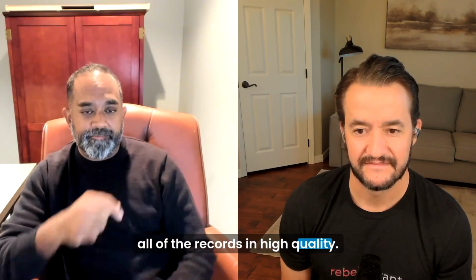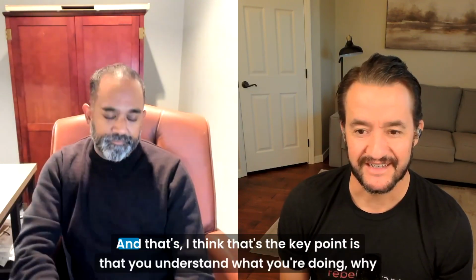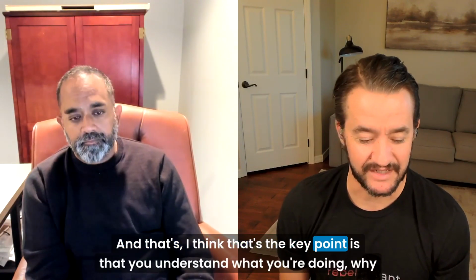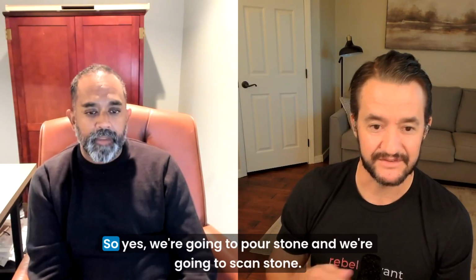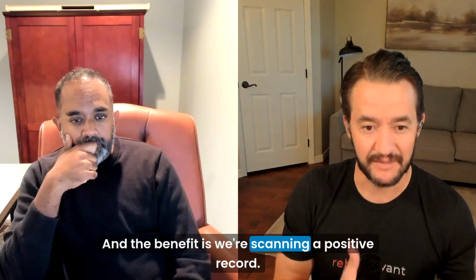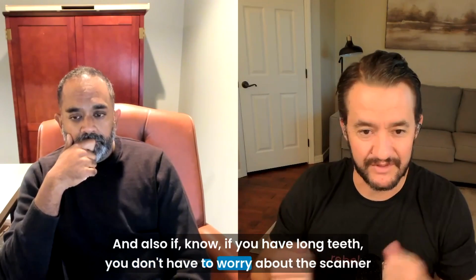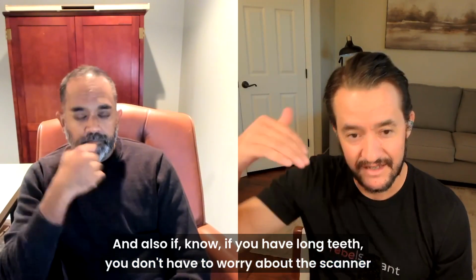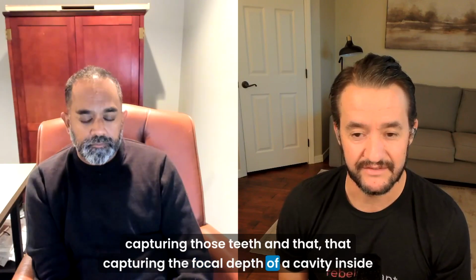Yeah. So your use of stone is purposeful, right? And I think that's the key point, is that you understand what you're doing, why you're doing it. So yes, we're going to pour stone and we're going to scan stone, and the benefit is we're scanning a positive record. And also, if you have long teeth, you don't have to worry about the scanner capturing those teeth and capturing the focal depth of a cavity inside of an impression.